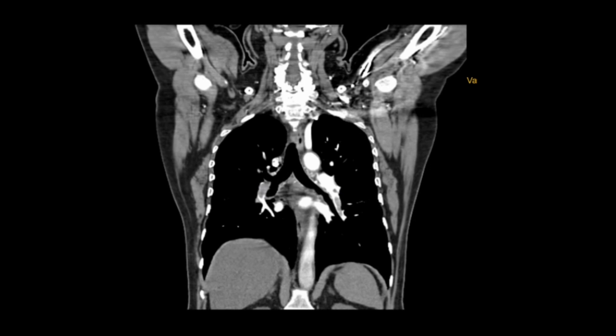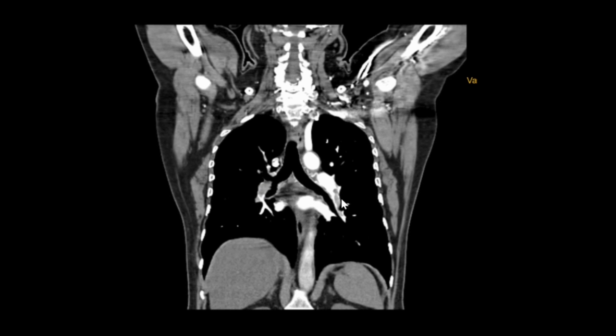These are very well visualized to be partial filling thrombus because the rest of the arteries are filled with contrast.